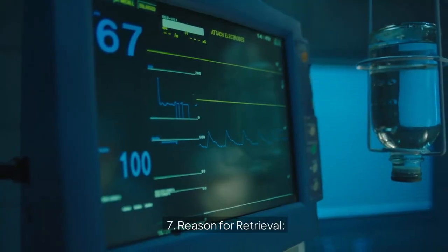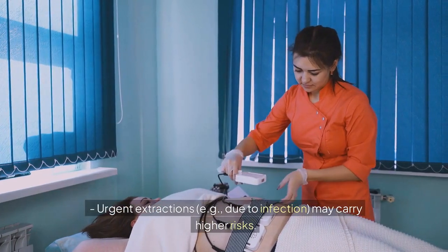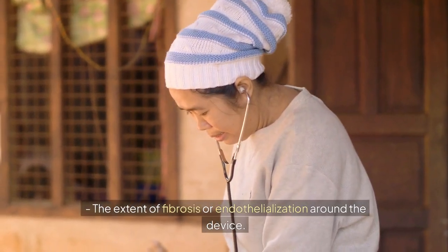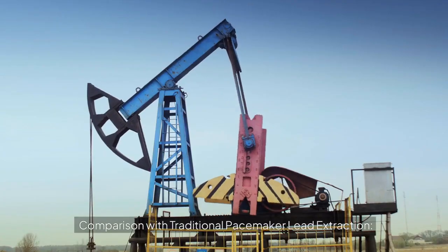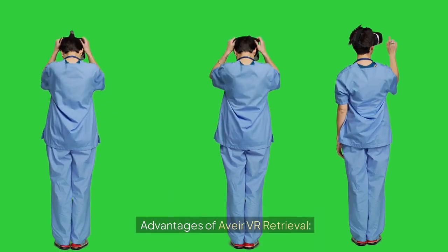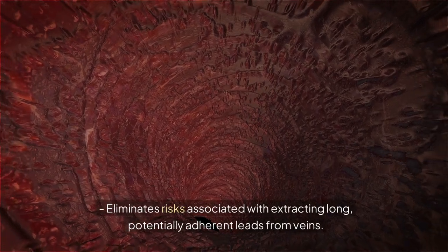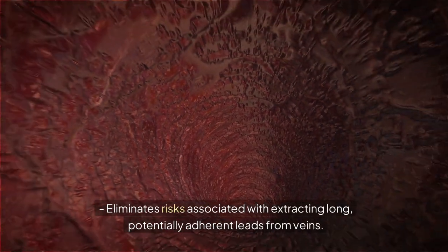7. Reason for retrieval. Urgent extractions, e.g., due to infection, may carry higher risks. 8. Tissue response. The extent of fibrosis or endothelialization around the device. Comparison with traditional pacemaker lead extraction. Advantages of Aveir VR retrieval. 1. No long lead to extract. Eliminates risks associated with extracting long, potentially adherent leads from veins.